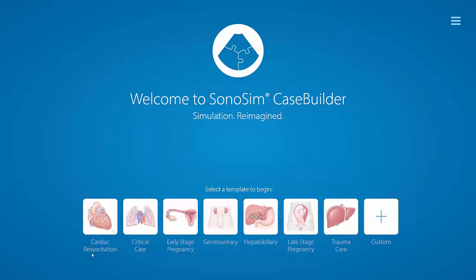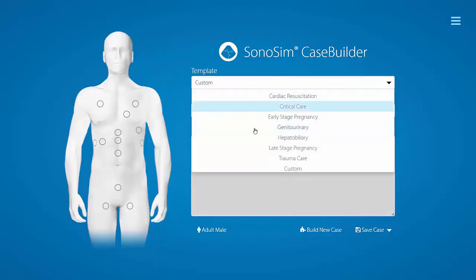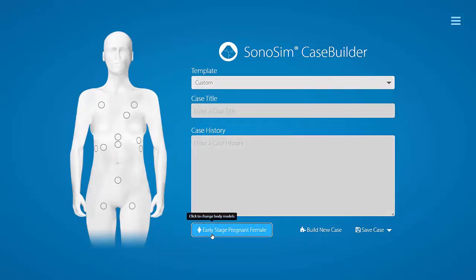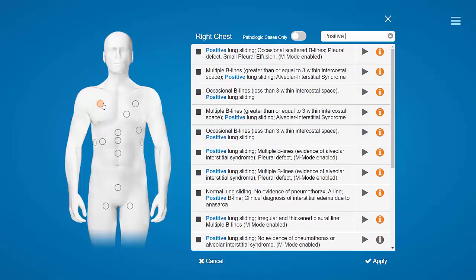And the case we're going to create today and talk about is an 18-year-old patient who suffers a gunshot wound to the left upper quadrant, as well as the left lower chest. So here you can actually type in your clinical history. We're going to make this person have a tension hemopneumothorax and be physiologically unstable. So you can type in, this is what a user would see. So a user would go to SimStation 1. So this could be a manikin or a volunteer. They would load the case, and they would subsequently be exposed to that history.